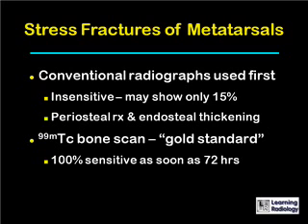Technetium-99m bone scans are considered the gold standard. They are virtually 100% sensitive, and they are sensitive to stress fractures as soon as 72 hours after the injury. Unfortunately, they're not as specific as they are sensitive, so that conventional radiographs need to be obtained in association with the bone scan.